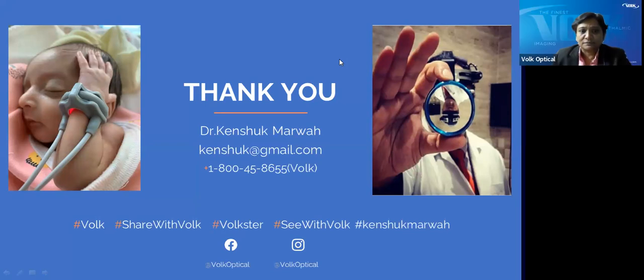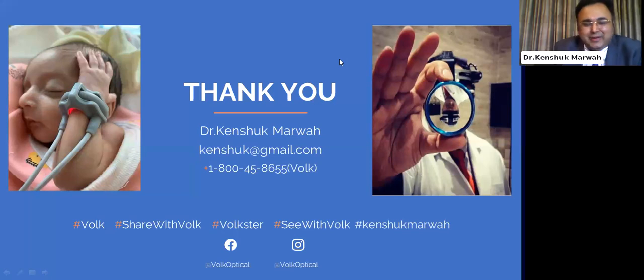Thanks, doctor. You have touched upon the cleaning part of it, but the question is how to avoid getting scratches on the lens and increase its lifetime. I visit a lot of clinics, and when I don't see a lens kept properly, it really irks me and irritates my nerves. I'm a very patient guy, but sometimes we unknowingly keep the lenses on the table. It should always be kept in a case, and you should never touch the lens surface, because you leave a thumb imprint.